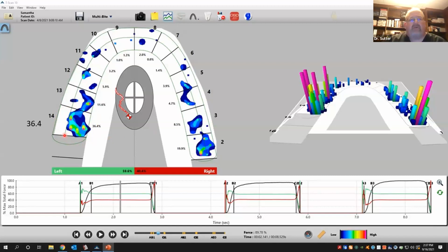And you're going to answer the patient however you feel, but wouldn't it be good to know, like, hey, Samantha, this was the exact conversation we had. Samantha, everything really looks good. I don't have any concerns with gum disease or periodontal disease with you. I really don't see any cavities. However, the bite, I've got some concerns about. Look at how much force are on these 2 teeth.